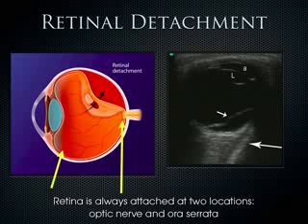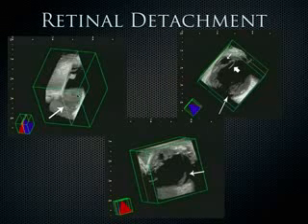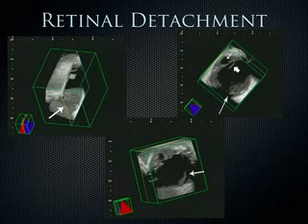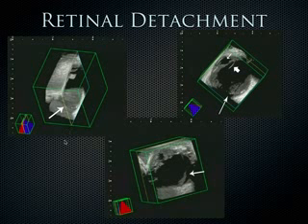And so we can see the anterior chamber there and the lens. And this is one of our machines that does 3D. We can see the retina sort of peeling off the back of the eye in this particular view here on 3D ultrasound. Gives you the sense that it's not just a linear thing that we think about on 2D. It's really this whole three-dimensional envelope that peels off the back of the eye like an onion skin here, seen on three-dimensional ultrasound.